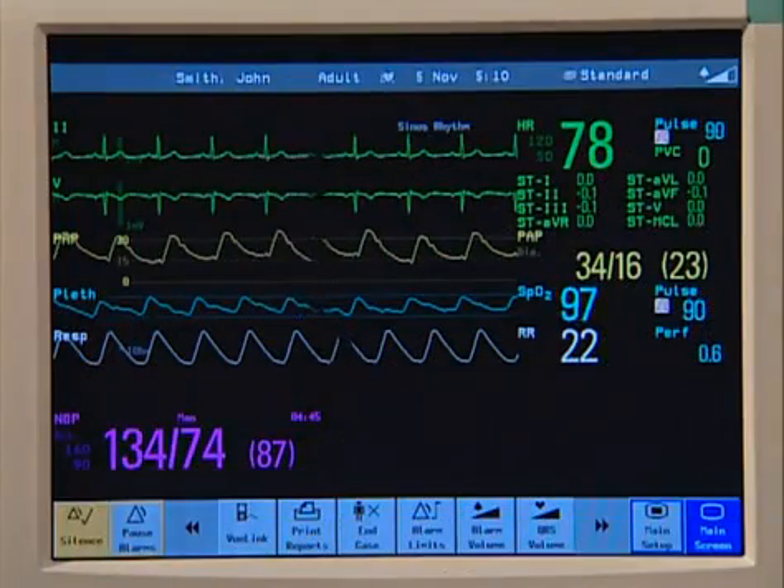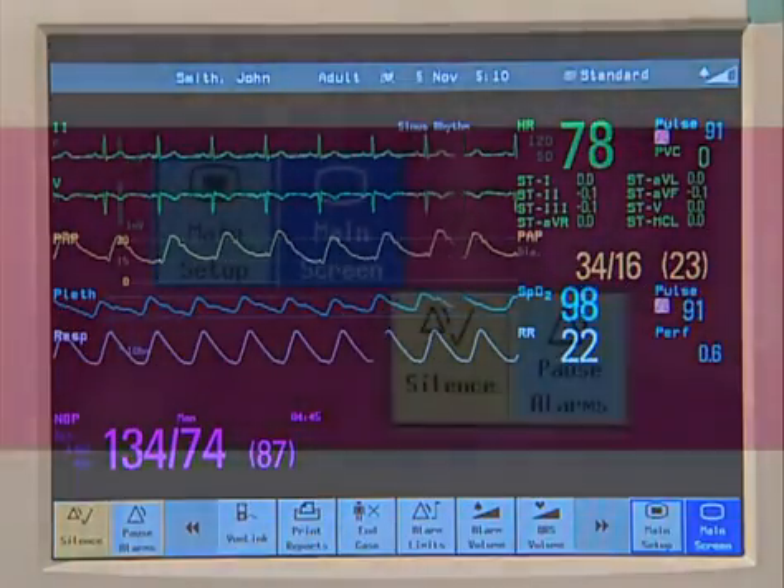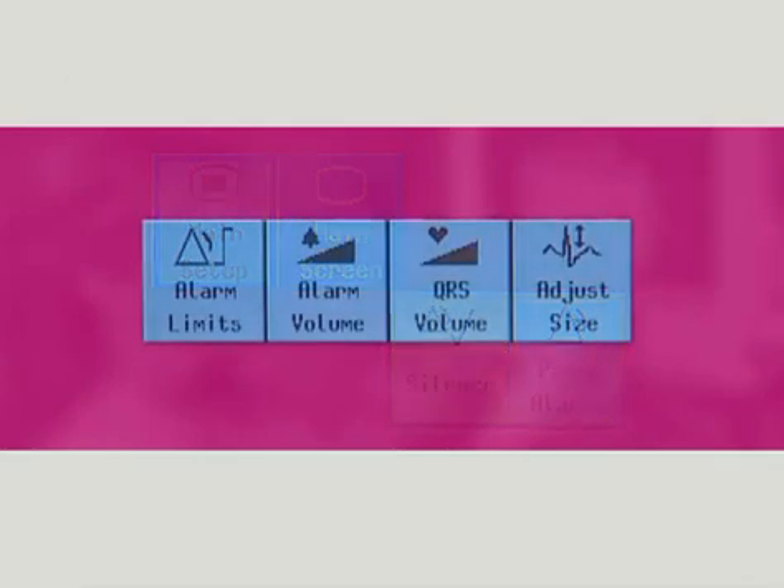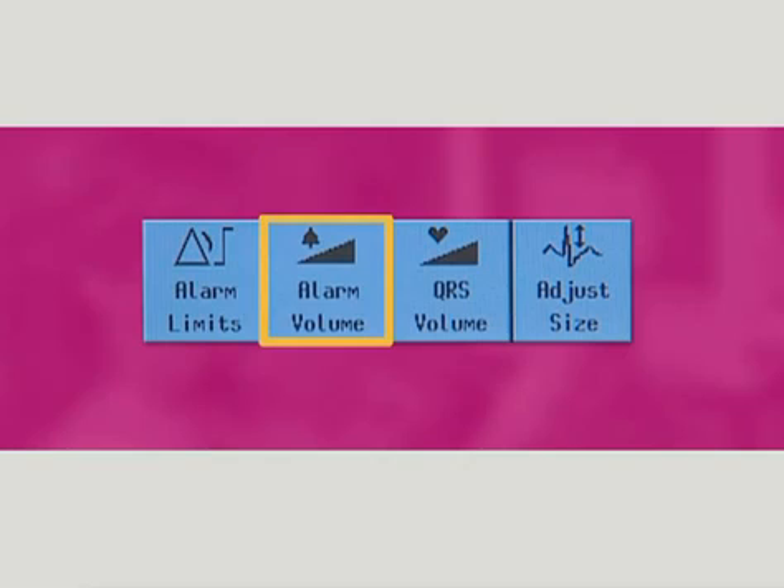The monitor has four different types of keys. Permanent keys remain on the screen all the time to give you fast access to functions — these include the main screen and main setup keys. Smart keys are graphical keys located at the bottom of the main screen. They give you fast access to frequently used functions. Their availability and order depends on how your monitor is configured. An example of a smart key is the change alarm volume key.